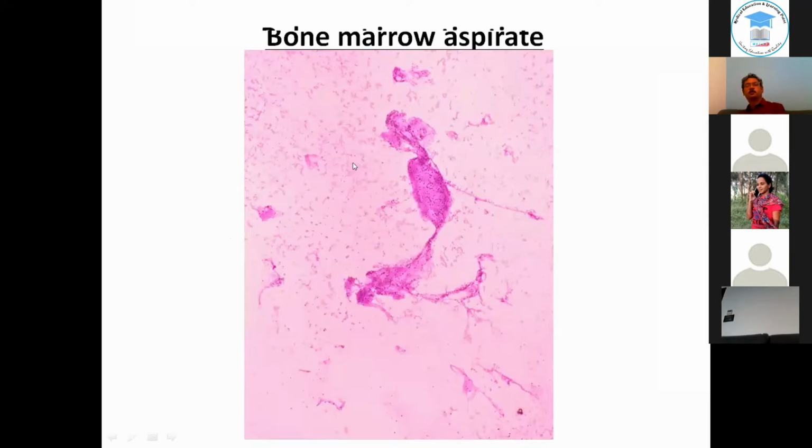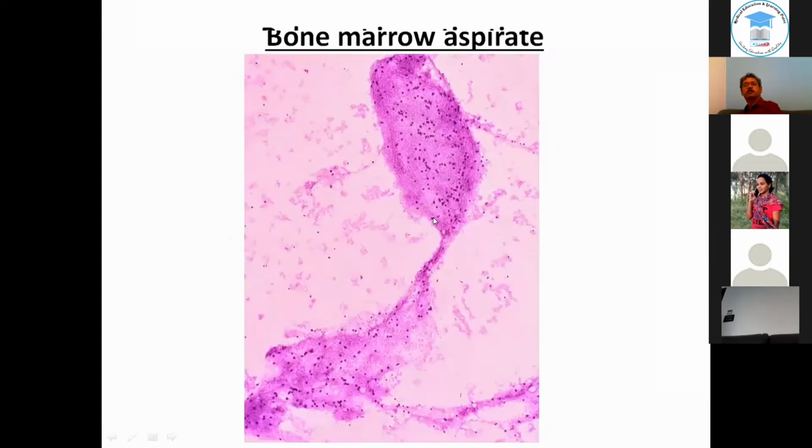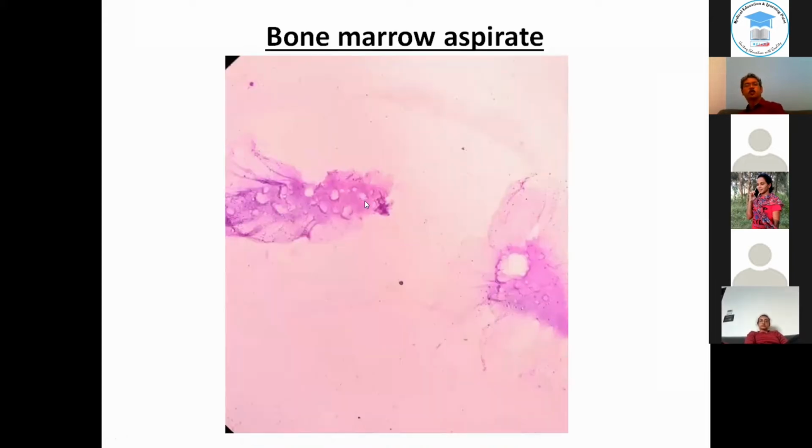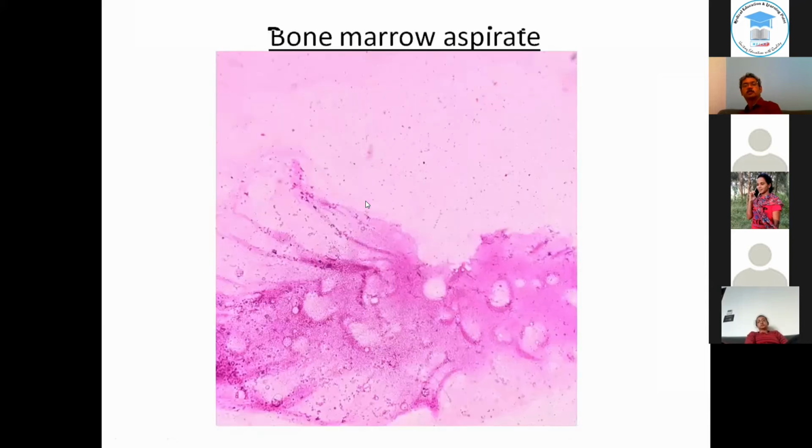And obviously, you can't see any hematopoietic cells out here, but you can see some pinkish purple stuff. Again, a few hematopoietic cells in this. They look like mononuclear cells. Again, yes, lymphocytes and plasma cells in this granular kind of purplish material. Again, more purple material and no hematopoietic cells. More of the same. And a trephine shows no hematopoietic cells, but something going on all right.